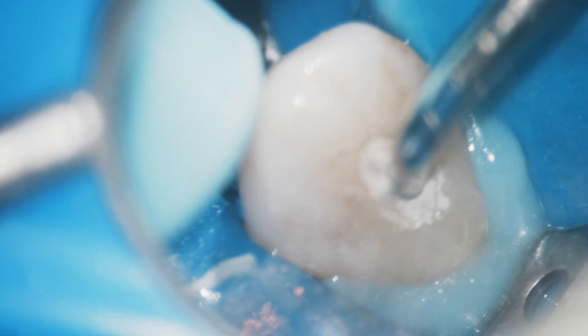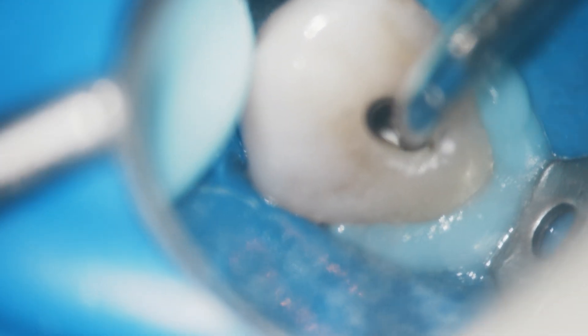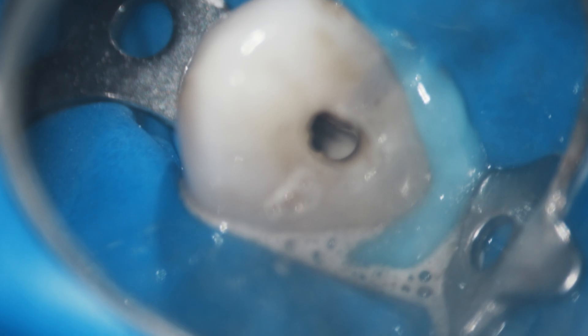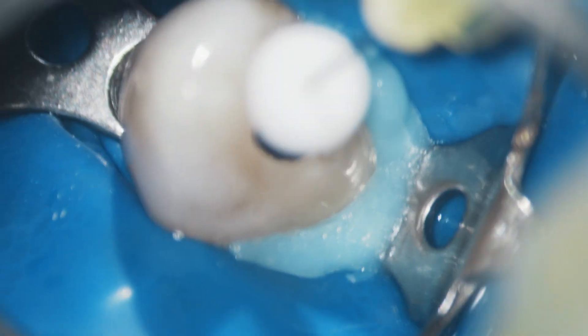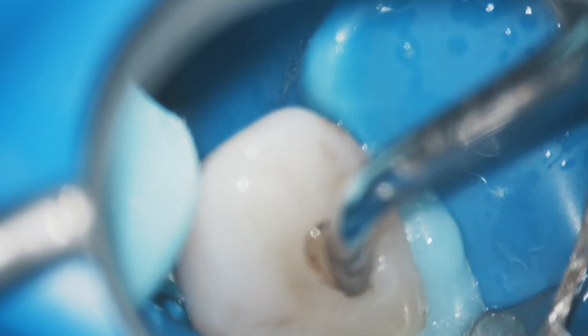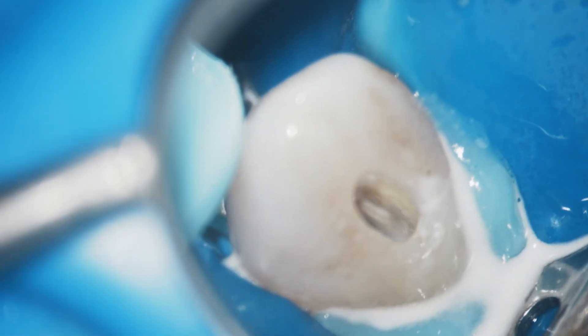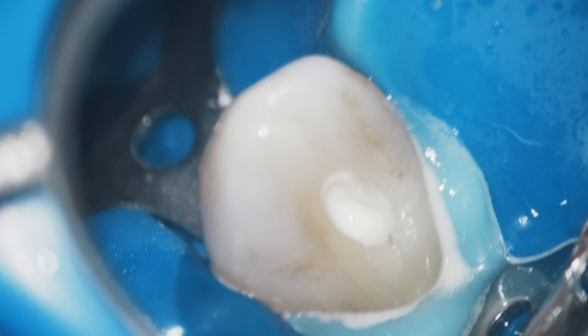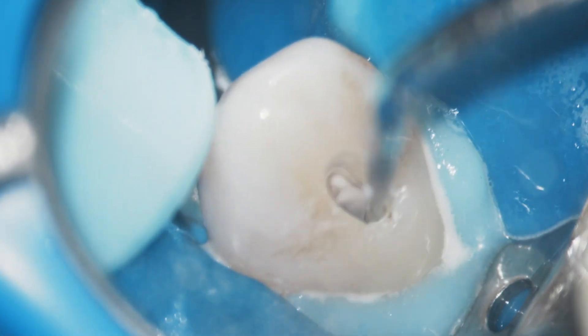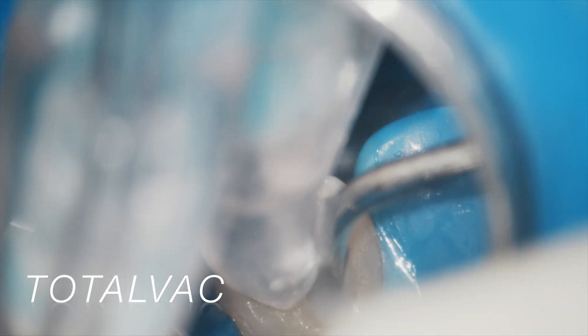The use of ultrasonics — I'm a huge fan, having used them for the past 30 years, including constant ultrasonic irrigation with simultaneous water flow. We continue this cycle as it breaks up and removes the broken stone, which is not easy. You have to be careful not to rush because as soon as that calcification — almost like a cork — falls into the canal, you'll have a problem. The Total Vac with the ultrasonic allows you to do continuous ultrasonic irrigation with Triton, or just continuous sodium hypochlorite alone.